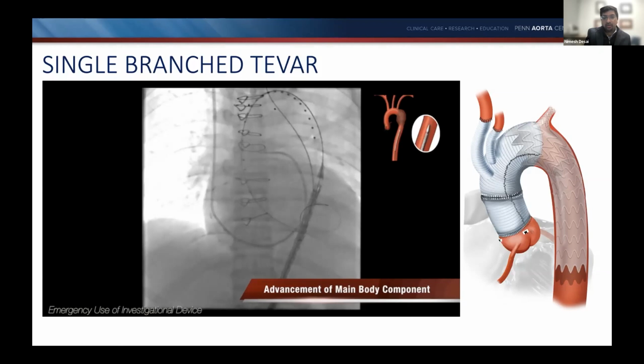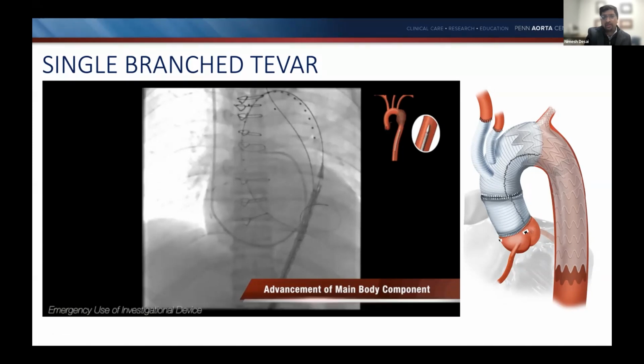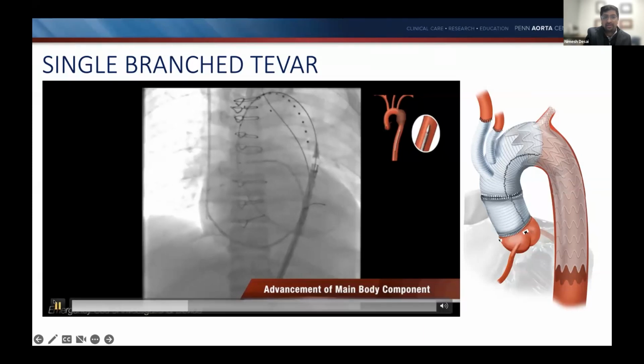is from the arm, brought out through the groin, through the GORE sheath, and placed in that second portal lumen of the device. And the device is brought up. One of the things that we're really careful about is wire wrap. So the rotational alignment of the device is very important. And typically, if you're pulling a little bit on the through and through wire, the device will straighten itself out as you put it up. It's also very important to leave the wires in the right orientation as you're going up the groin. And that can help prevent any wire wrap, which would make it impossible to advance the device.